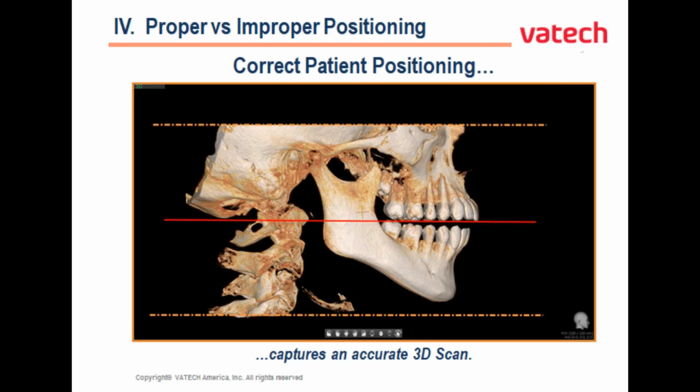And this scan here is actually an 18x10, so you can see the depth, anterior teeth back into the spine there, and then the height, inferior border of the chin down to the hyoid bone. Look how we are capturing the TMJ and actually the lower orbits of the eyes there.